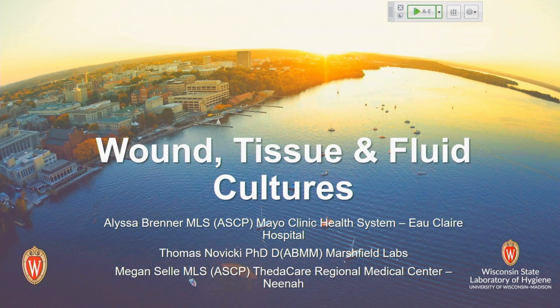I think a lot of people now are really into sonicating, taking the implant out, sonicating it and doing all this. Well, we can't do that. But these blood culture bottles for those tissues work really nicely. Then you just put them in the incubator for 14 days and let the blood culture instrument watch them. Good. Thank you, Ray.